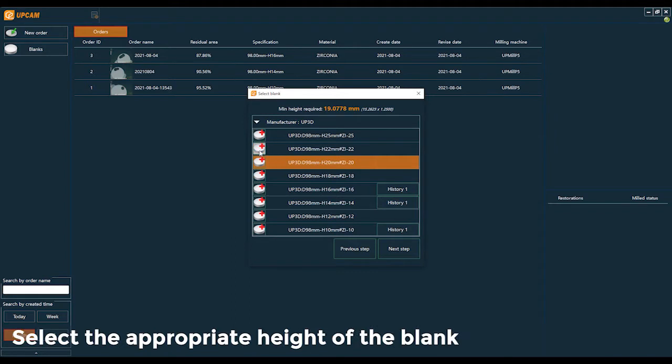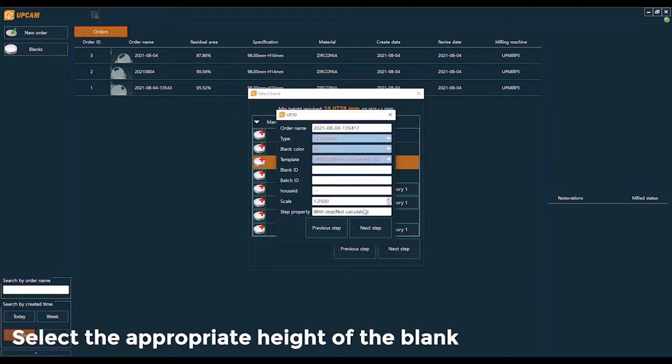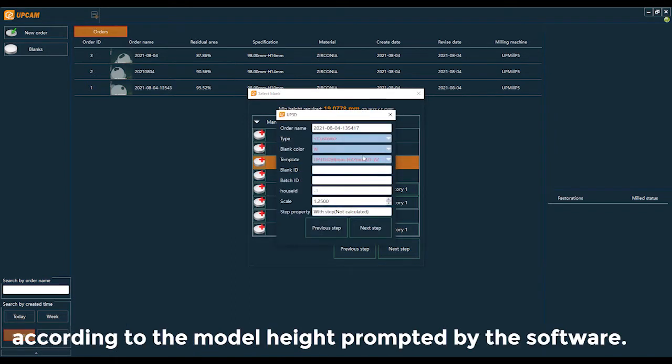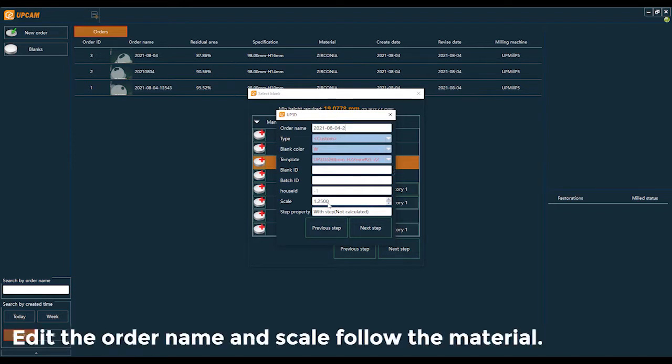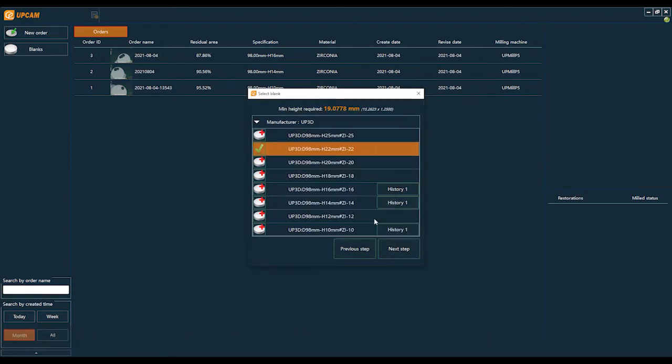Select the appropriate height of the blank according to the model height provided by the software. Edit the order name, scale, and material.